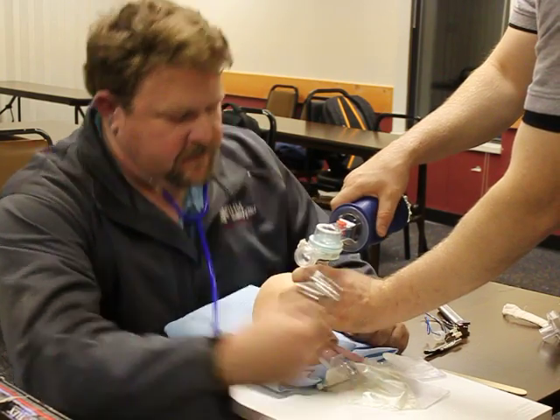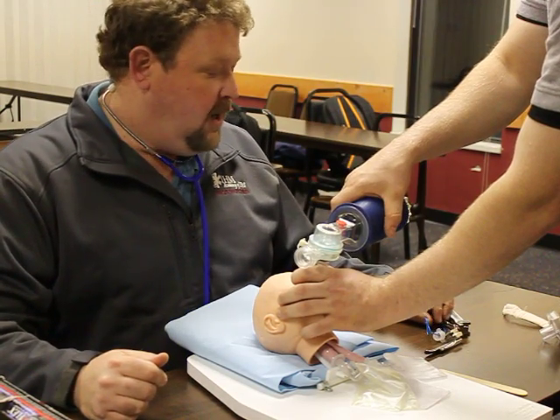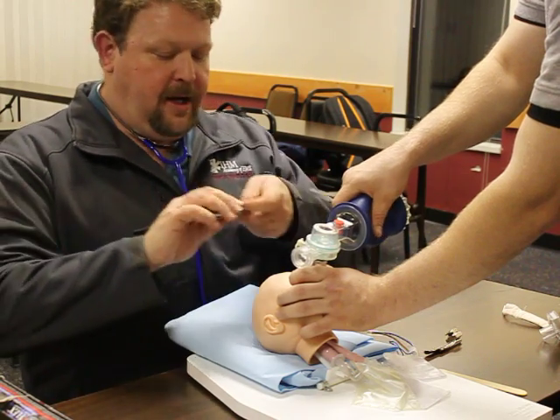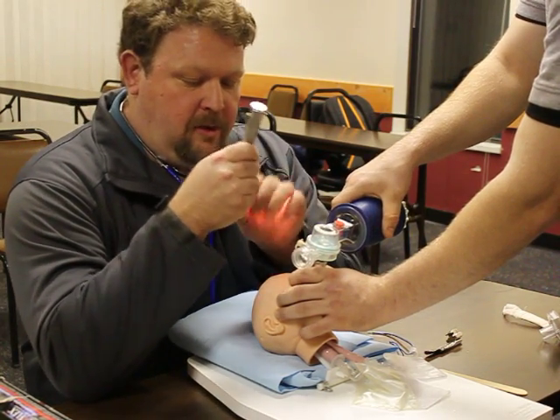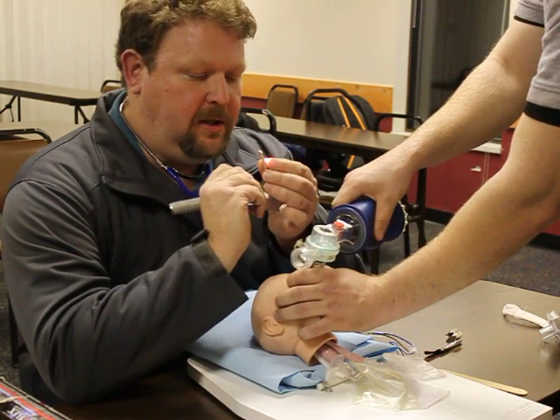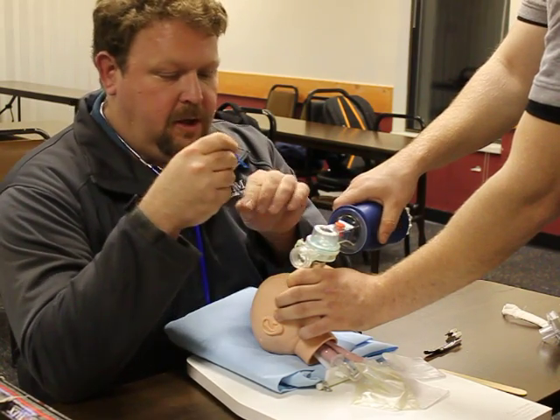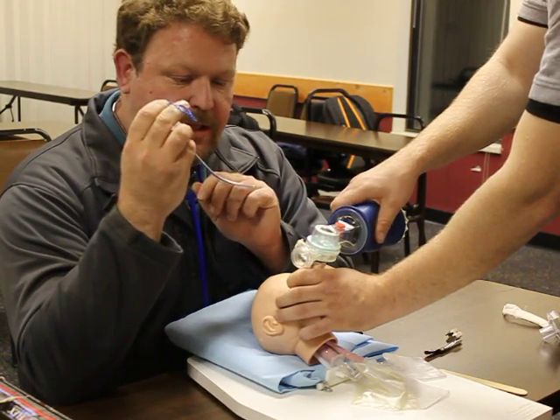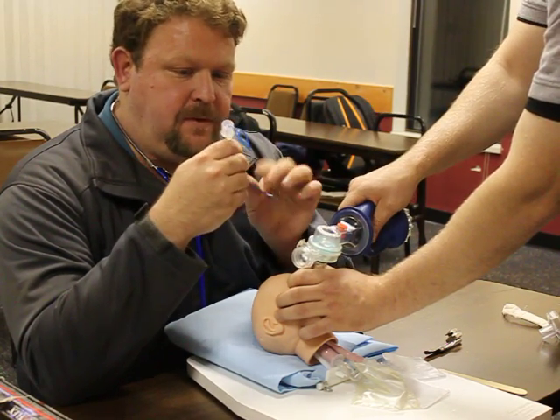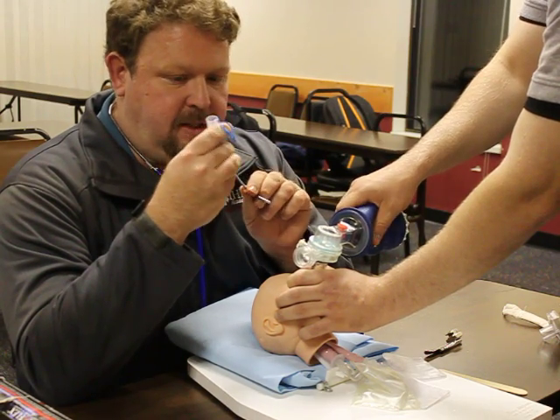I'm going to go ahead and direct my partner to pre-oxygenate the patient at one breath every three seconds. I'm going to check out my equipment — laryngoscope blade. For this procedure I'm going to go ahead and utilize a Miller. Ensure that my light is white, tight, and bright. I'm going to go ahead and select my uncuffed ET tube, utilizing a 2.5 for this infant. My stylet is in place, not extending past the end of the ET tube.